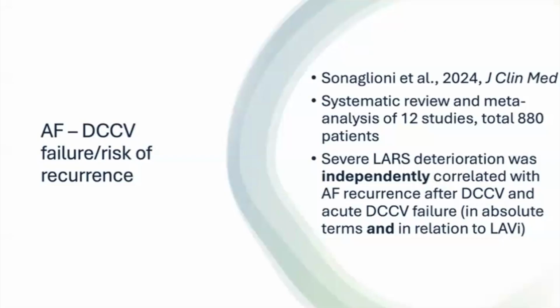So it makes me wonder, in the future, with this data, if it was borne out in future studies with more patients, whether left atrial strain analysis in patients with AF might play a role in how providers and patients might come to decide upon rate versus rhythm control strategies, or subsequent management of AF going forward.